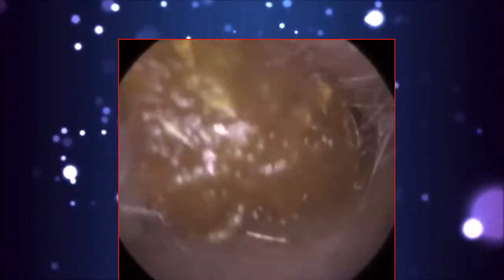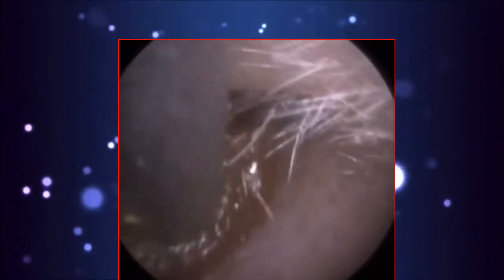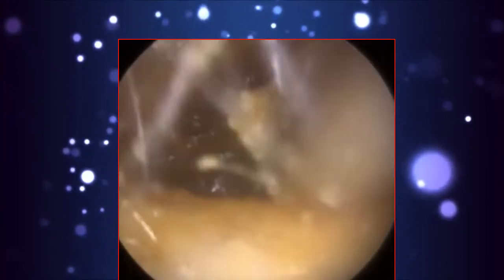This wax is trying to naturally migrate out of the ear, but when it reaches the entrance, because of the canal being slightly collapsed, it's preventing the wax from naturally migrating. You see we've got a large plug of soft wax there, and this final plug of wax is a bit more medial, it's towards the eardrum.